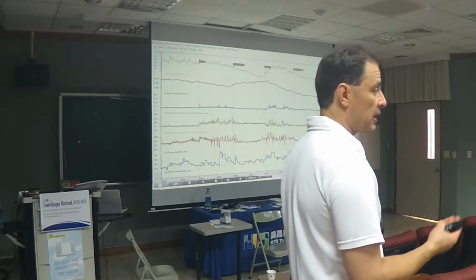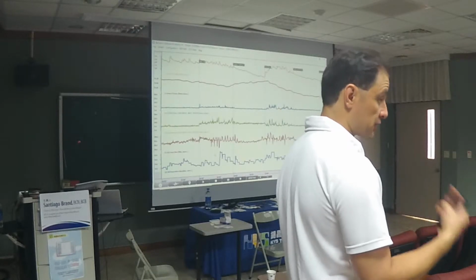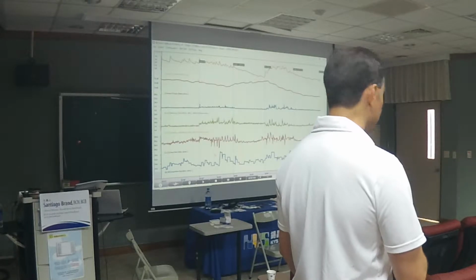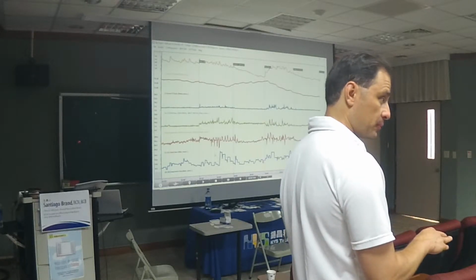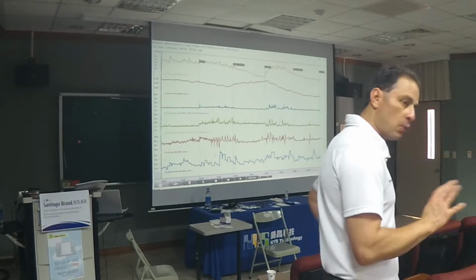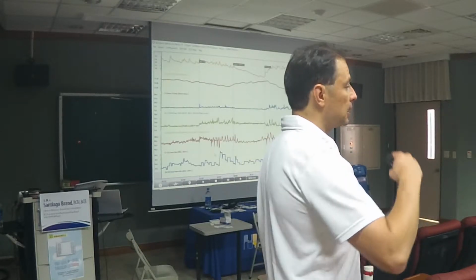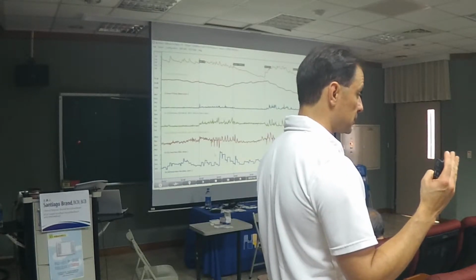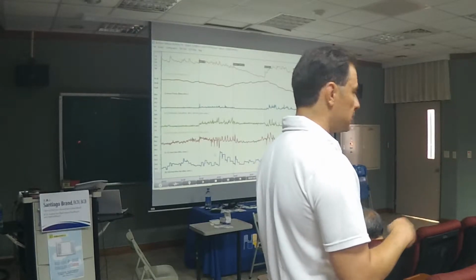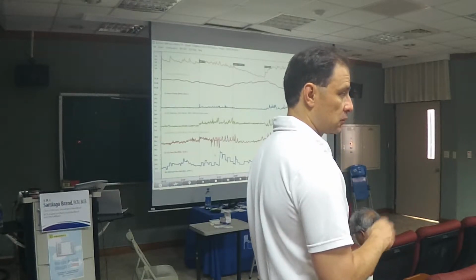Heart rate, depending on the client, but we want to go 5 to 10 heartbeats below the resting heart rate. And exercising and heart rate variability will help us do that. EMG, 5 microvolts or less for any muscle group, resting. Again, not doing movement, not walking, just resting. Temperature, 31, 33, as close to 36 as we can get, Celsius, and the GSR 2.5 or 3 microsiemens or below. So those are the measure units.